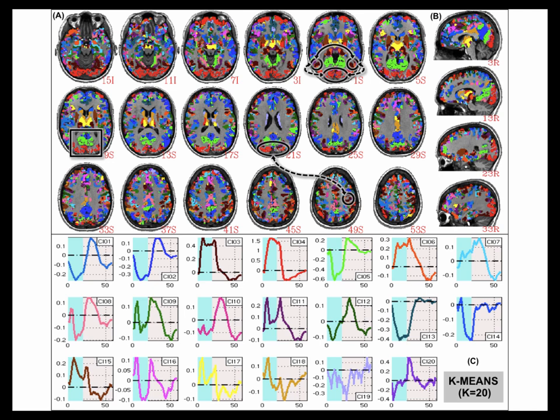Okay. So then if you're doing some kind of event-related... Well, no, it will still be a gamma variate function. It's just that the amplitude of the gamma is larger, and that's actually a good thing. I had a few other slides that helped clarify this, but I skipped them. For a very short stimulation, you still get a gamma variate. It's just that the amplitude is larger than you would expect from a linear system. So in a linear system, if you give a very short stimulation duration, like half a second, you'd almost have nothing left. You would barely see it.